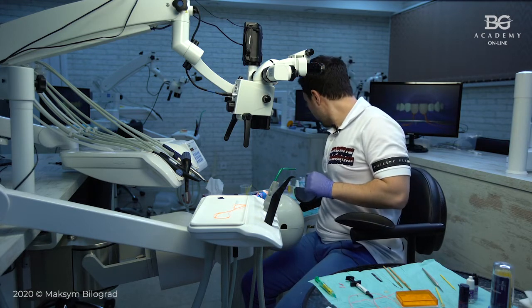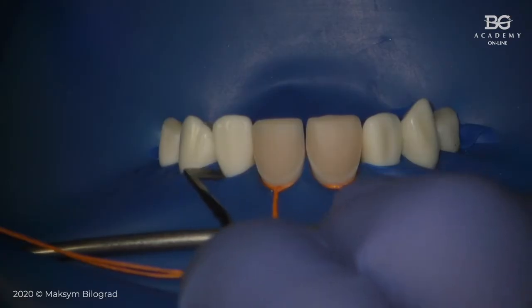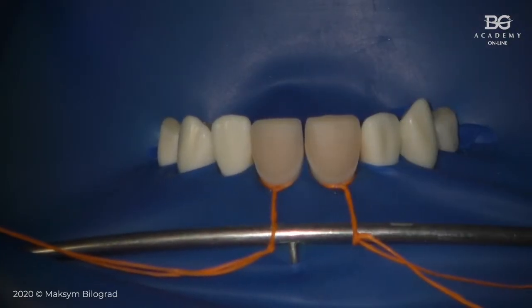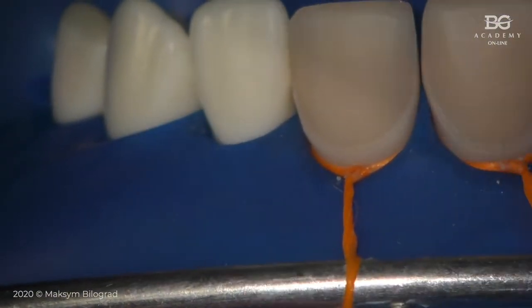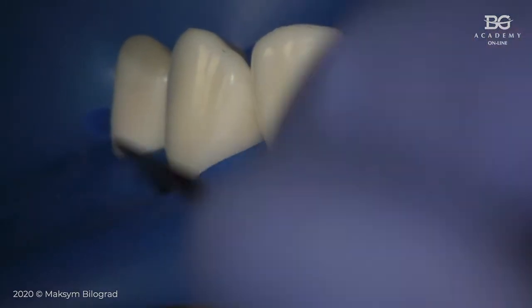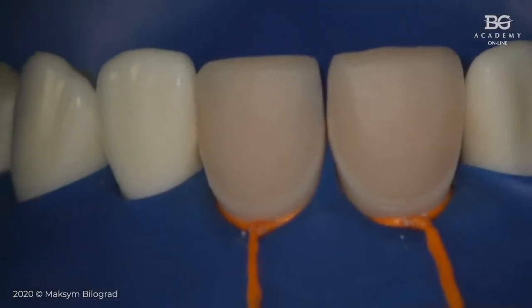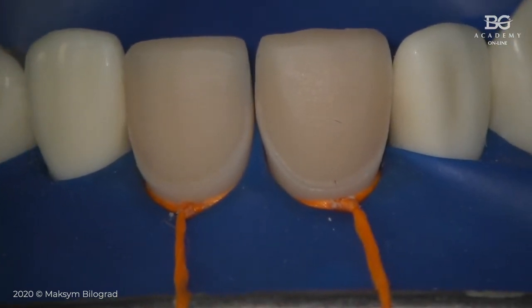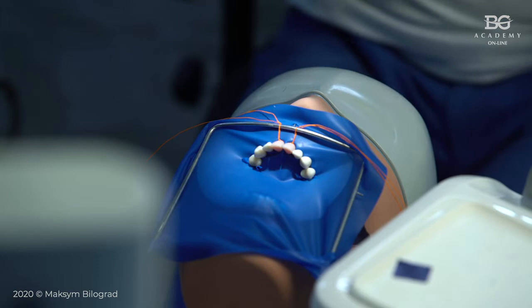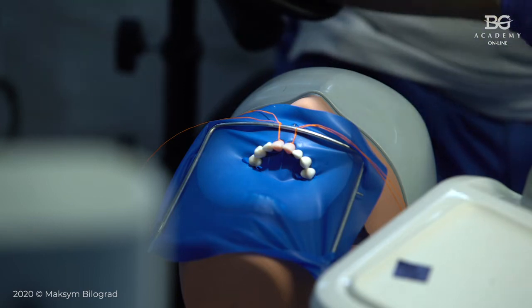Okay, before doing process of tissues preparations with bonding agents, be careful with inversion again, because sometimes when you tighten floss too much, you can get some margin opening on the adjacent tooth, like in this lateral incisor. So I will have to invert better. Here, see, there is not enough inversion, so I will make better inversion in case to make my cementation process stress-free. Okay, great. So now we have done our isolation, and we are ready for another steps.